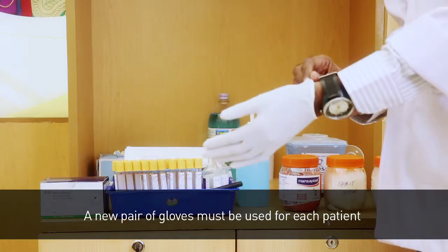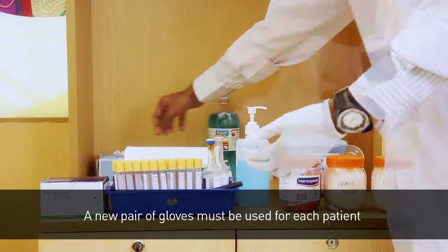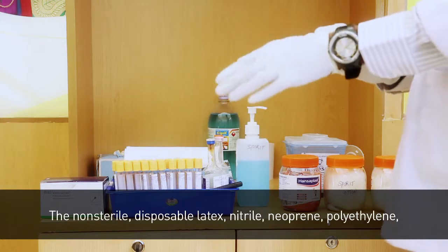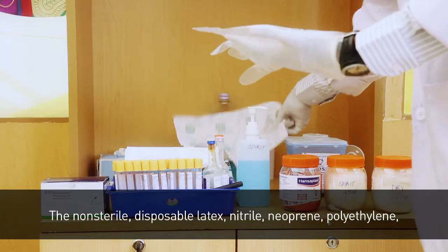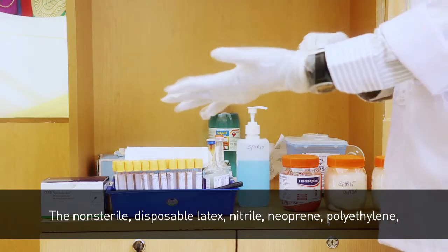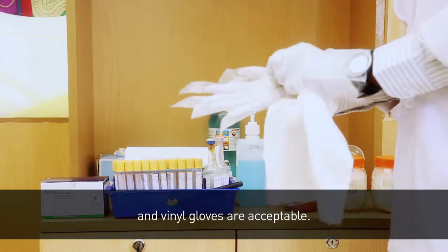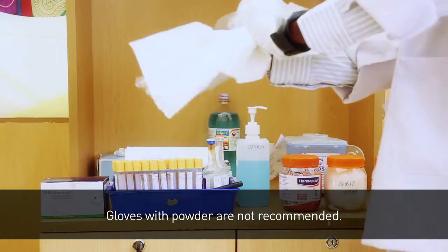A new pair of gloves must be used for each patient and removed when done. Non-sterile, disposable latex, nitrile, neoprene, polyethylene, and vinyl gloves are acceptable. Gloves with powder are not recommended.